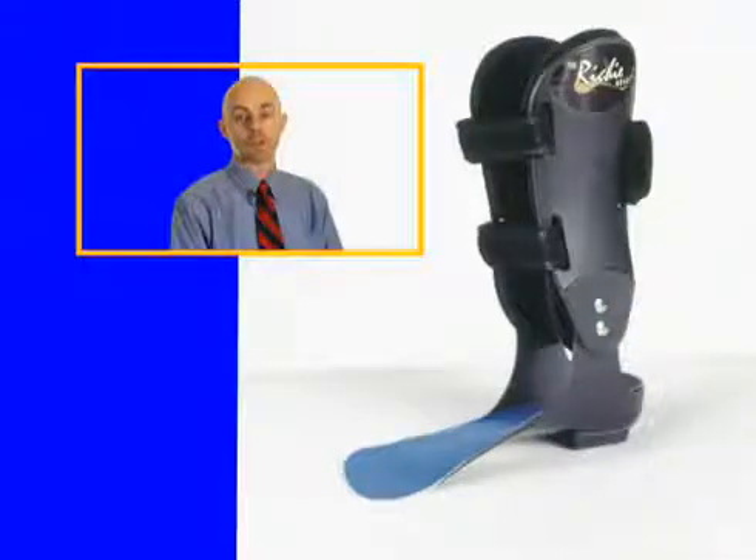First, let's take a look at the Ritchie brace. It was developed by a California podiatrist, Dr. Douglas Ritchie. It is used to treat certain cases of posterior tibial tendonitis dysfunction, arthritic degenerative joint disease and lateral ankle sprains.